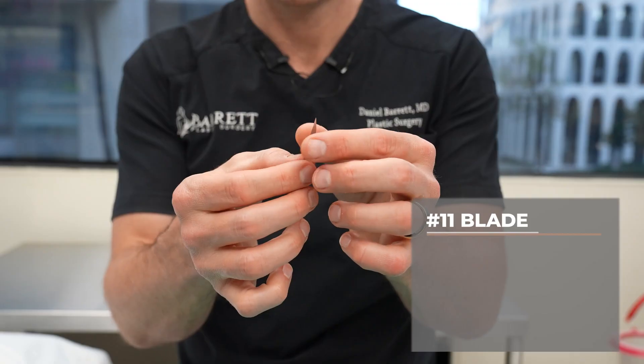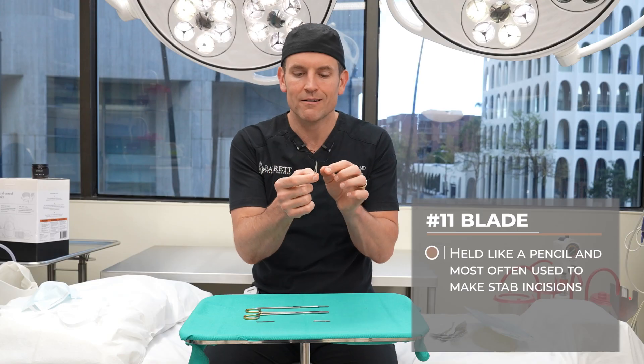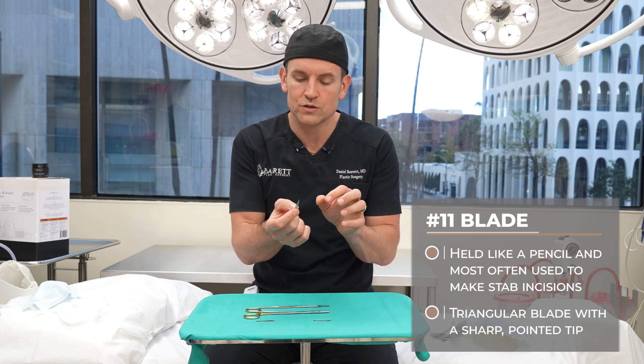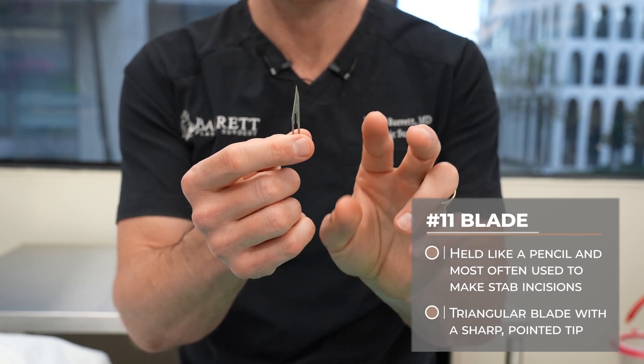Next one up is an 11 blade. This one's very pointy. We use this one to make stabbing incisions primarily. I'll occasionally use it to bring out a belly button in a little seesaw fashion, but it's very pointy. It is mainly meant for making holes for things like drains and so on. The way to remember an 11 blade is for 11 like this — very pointy.